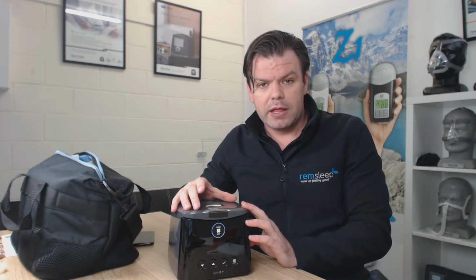And that's basically it at the end of the day. So that's really good. Let's talk about the comfort features. The main comfort feature that Fisher and Paykel have in this machine is what they call expiratory relief. Every company's got their own little name for it. When you breathe out against the pressure, the machine drops the pressure.